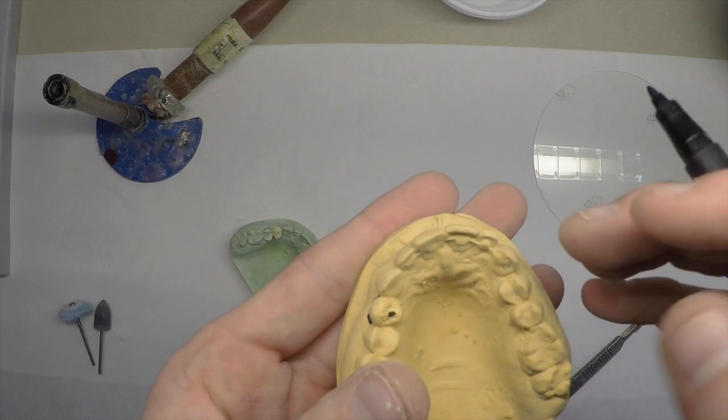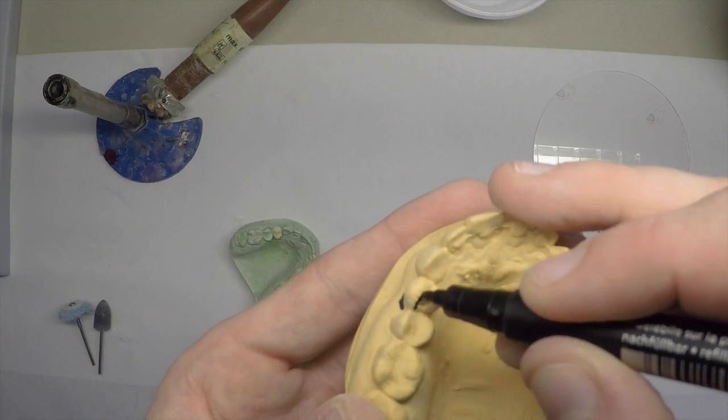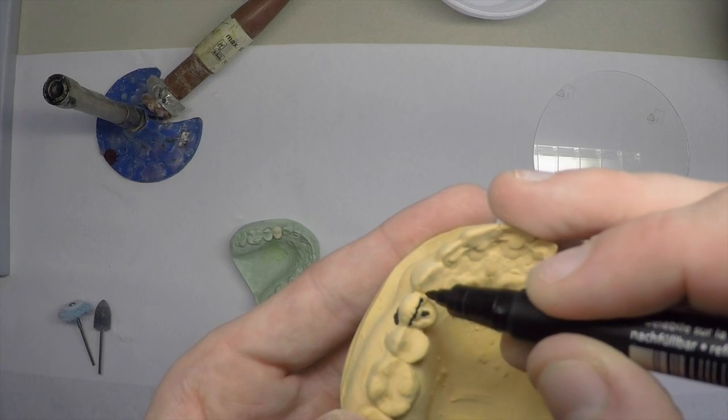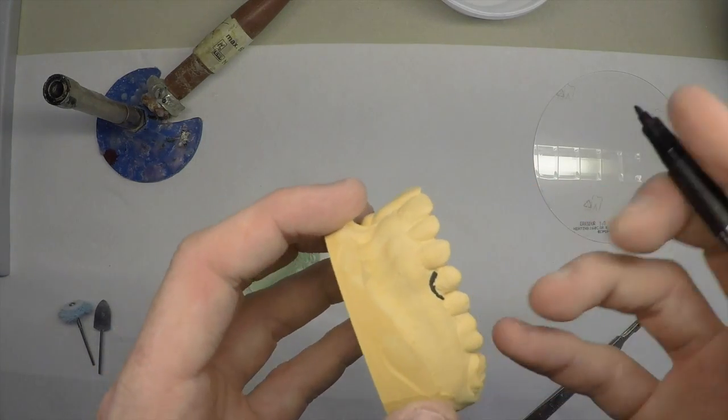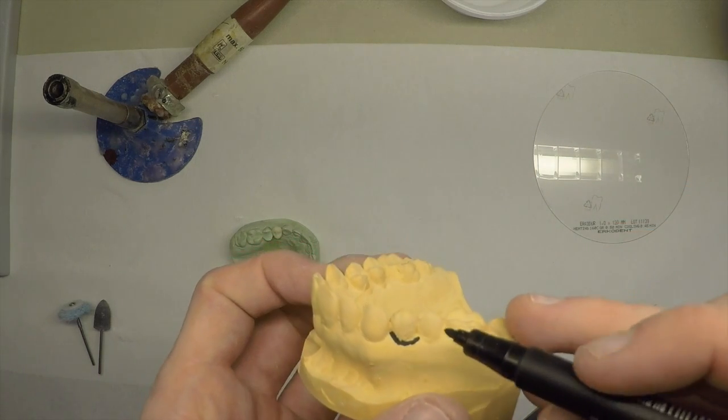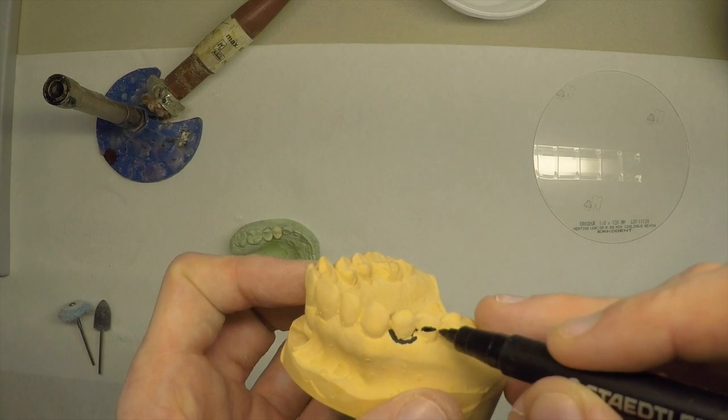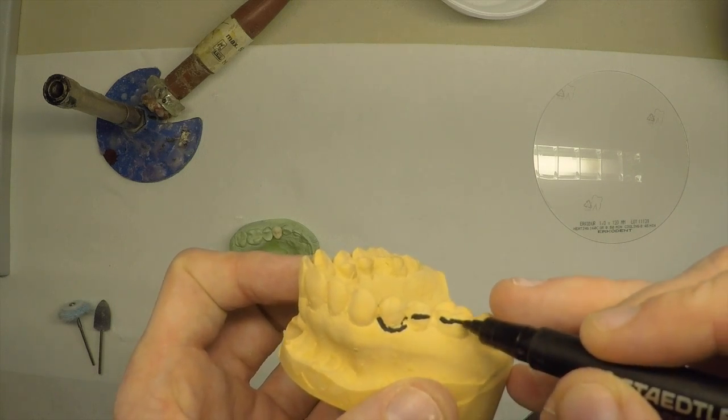Then we want to mark a line about a millimetre or two buckle to that. Then we want to mark lines where we want the rest of the tooth support of the stent is going to go. So we want to have it half tooth all the way around.